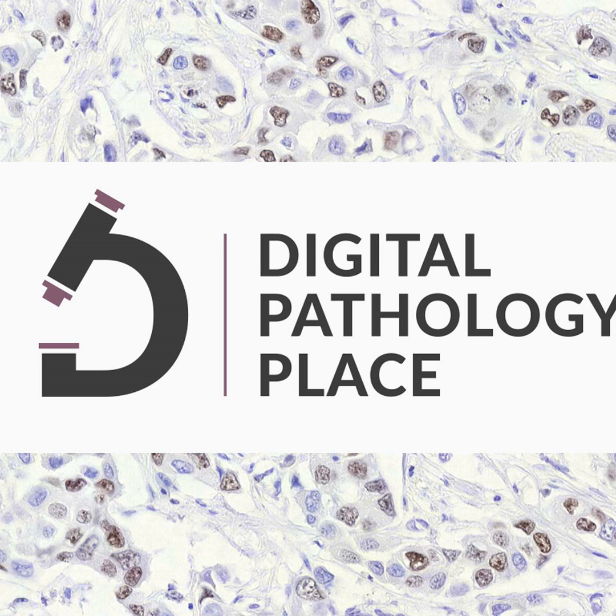And flowing from the SOP comes mandatory training. Every RP and relevant tech needs documented competence training before they touch the tool for clinical work. They have to understand what it does, how it works, and critically, what it doesn't do. Okay, tool validated, SOP written, team trained. It's live in production. Is the job done?